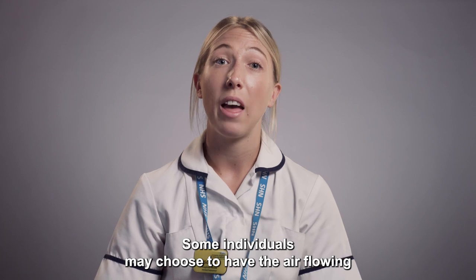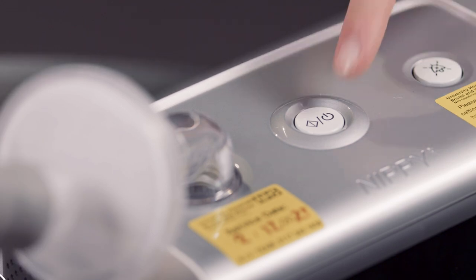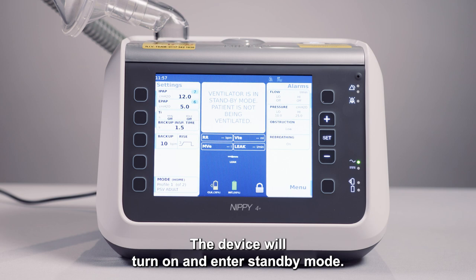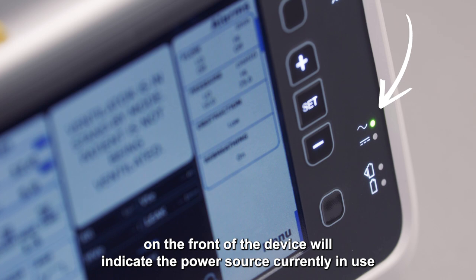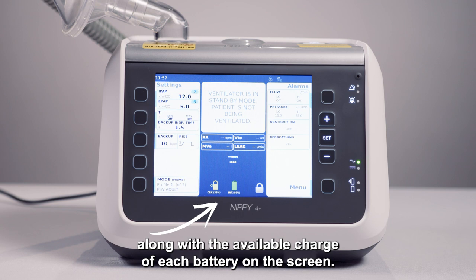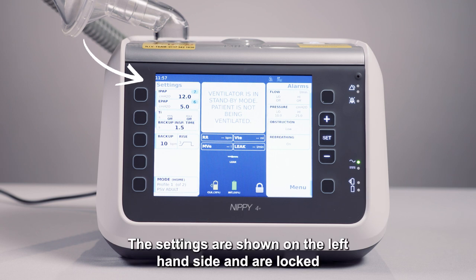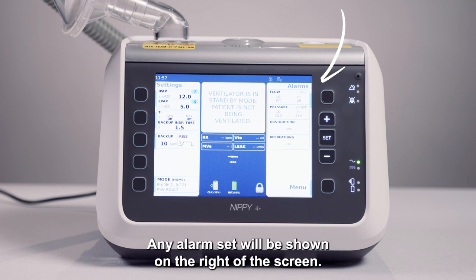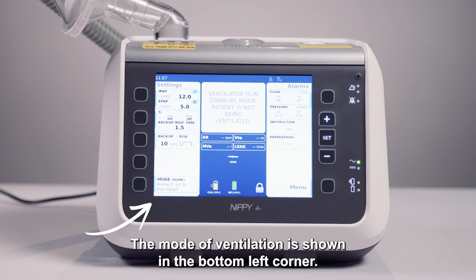Some individuals may choose to have the air flowing or the ventilator switched on before applying the mask. Press the power button on the top of the device. The device will turn on and enter standby mode. An LED light on the front of the device will indicate the power source currently in use, along with the available charge of each battery on the screen. The settings are shown on the left hand side and are locked so you are unable to accidentally change them. Any alarms set will be shown on the right of the screen. The mode of ventilation is shown in the bottom left corner.